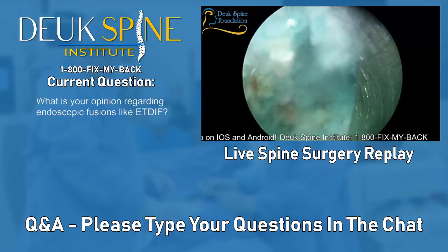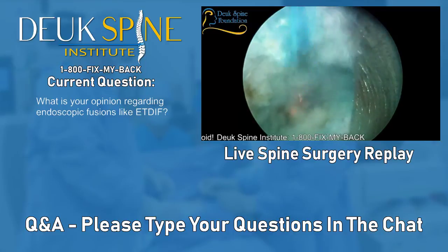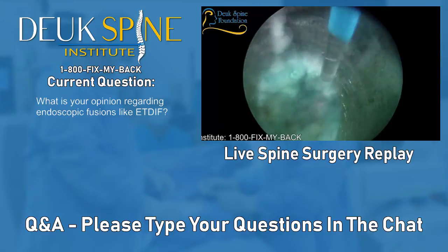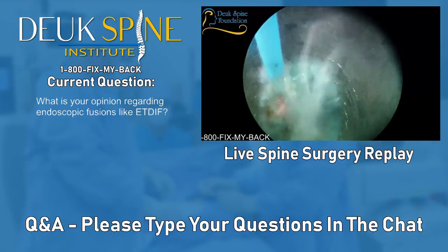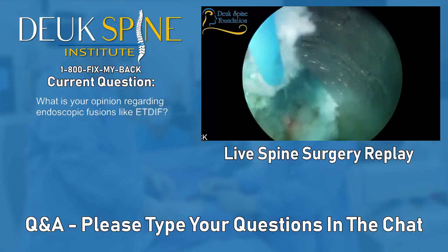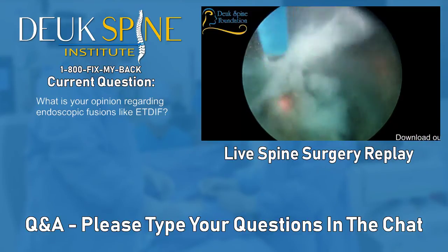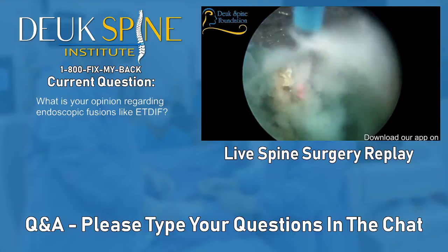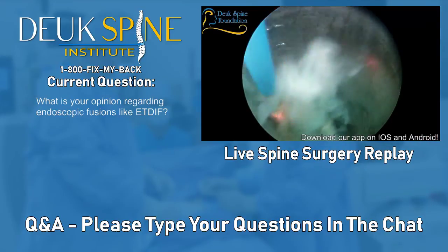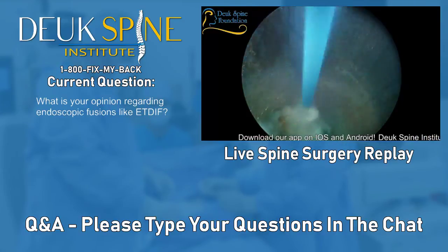And if you're interested to know how I did them in 2006, it was pretty incredible. I used something called the transfacet pedicle screw, which is percutaneous. It's basically a screw that goes into the pedicle but through the facet joint. So it goes into the inferior facet first of the superior vertebral body of the segment that you're going to fuse. And then it goes into the pedicle of the body below. And I did those along with interbody cage and interbody fusion, all done transforaminal along with a discectomy.